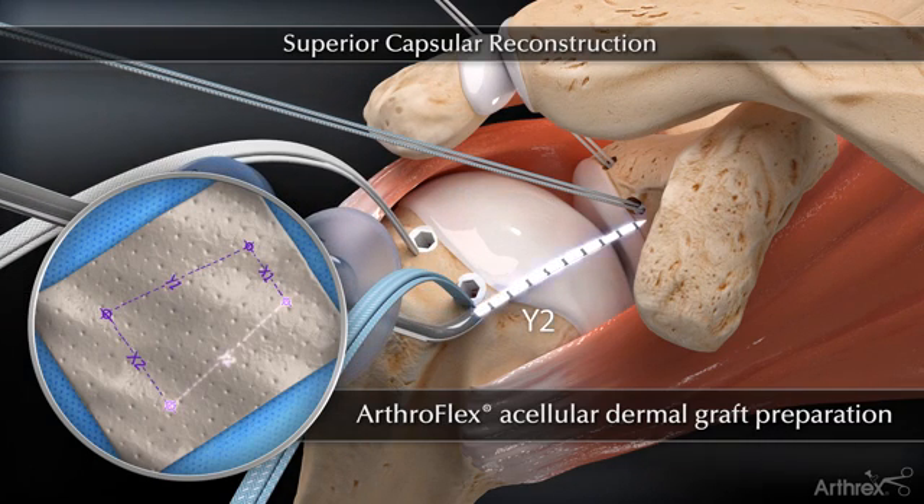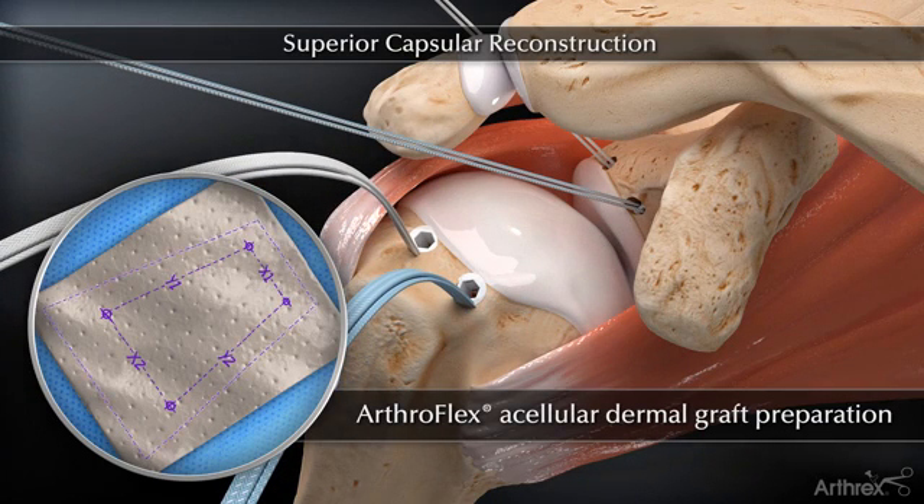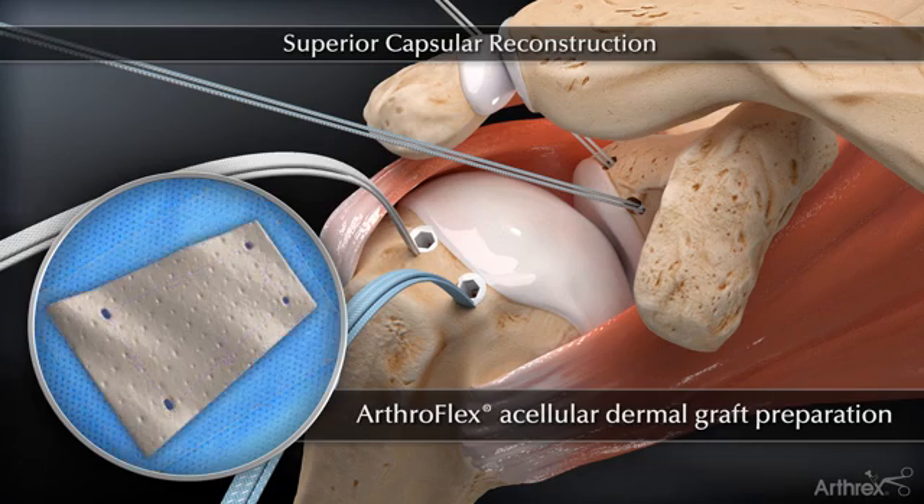Small holes are made in the ArthroFlex graft at the corresponding anchor locations to simplify suture passage and ease suture sliding when positioning the graft.